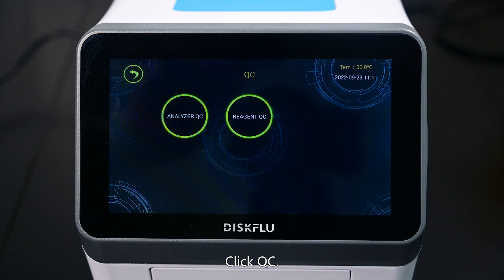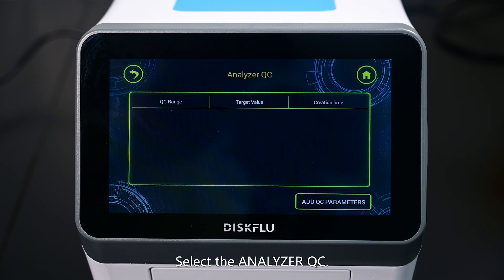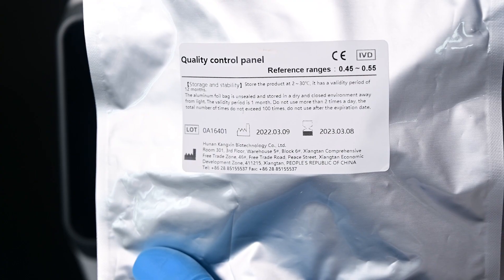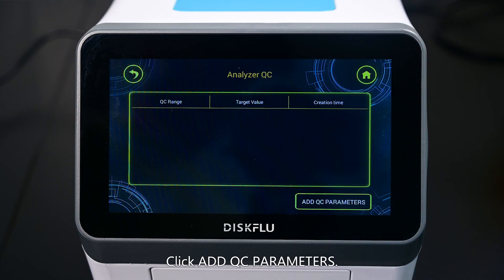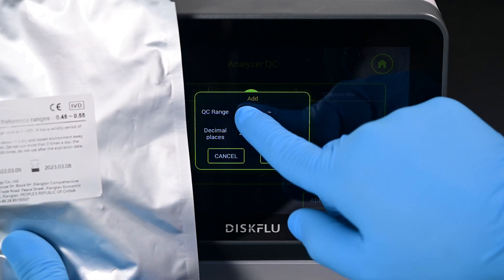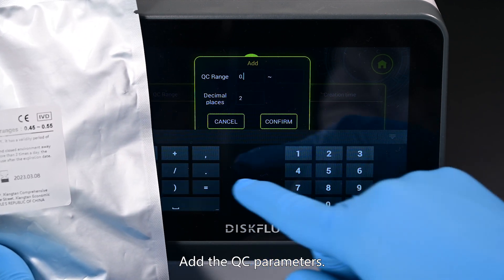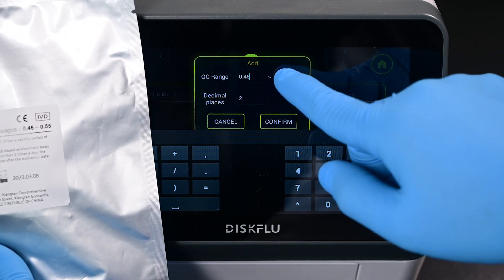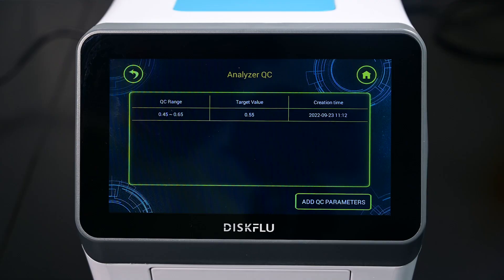Click QC. Select analyzer QC. Click add QC parameters. Add the QC parameters. Click confirm.